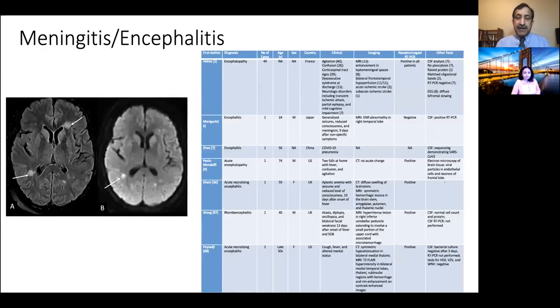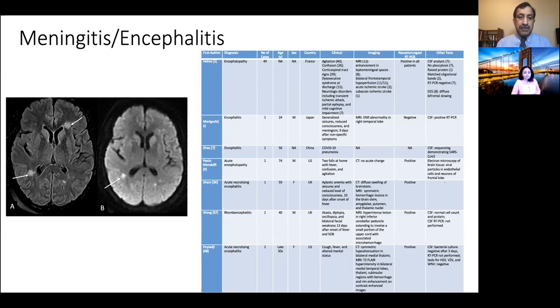Cases of meningitis and encephalitis have also been described in the literature, summarized in Table 3. On review of these papers, it appears that many neuroimaging manifestations have been labeled as encephalitis, and whether neuroinvasion is the cause of such findings is not entirely clear. Syndromes due to coagulopathy, cytokine storm, and acute demyelinating encephalomyelitis have also been included within this syndrome, as seen in this particular set of images.